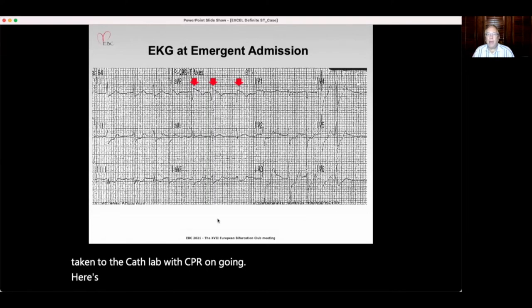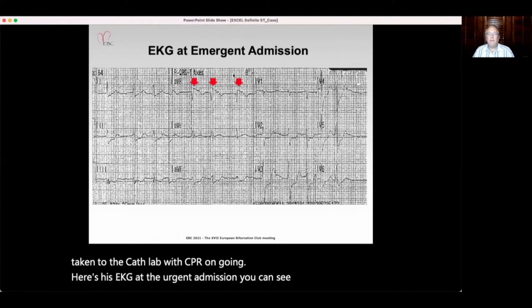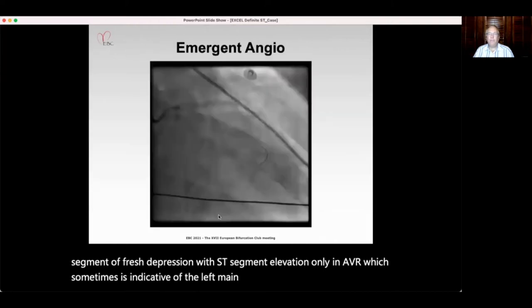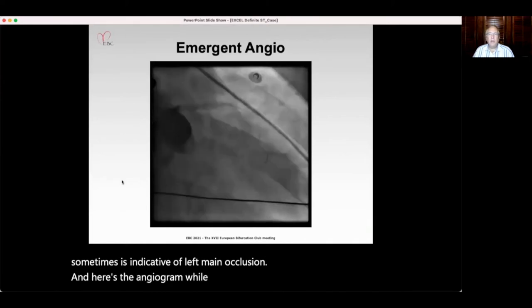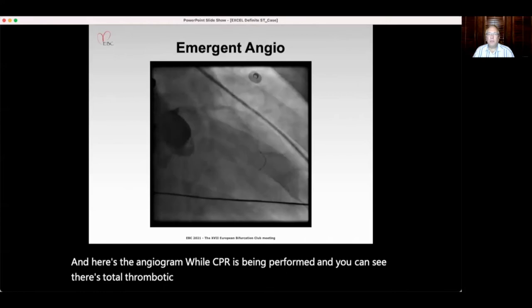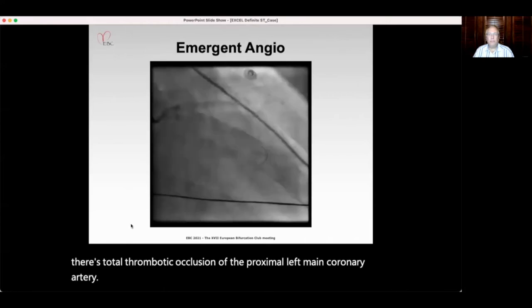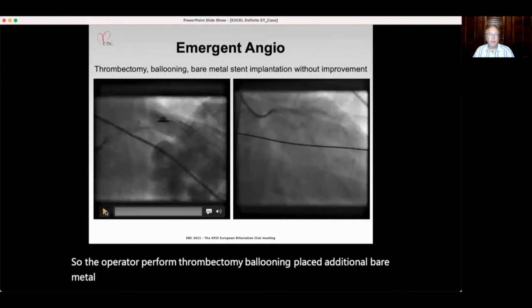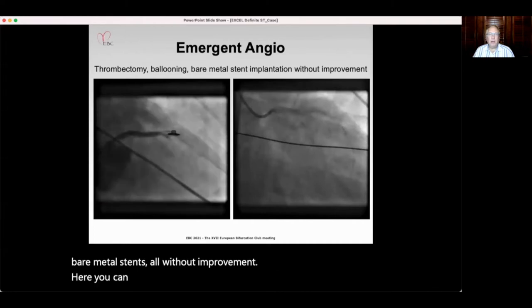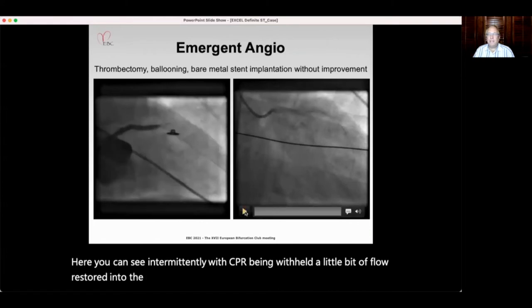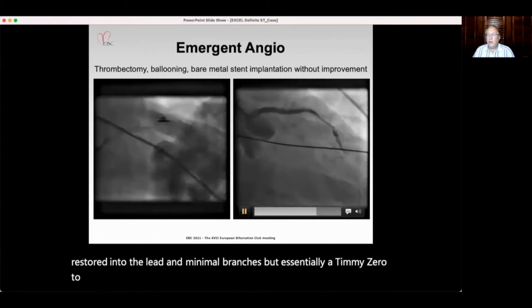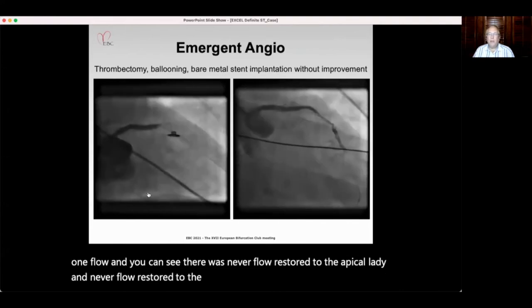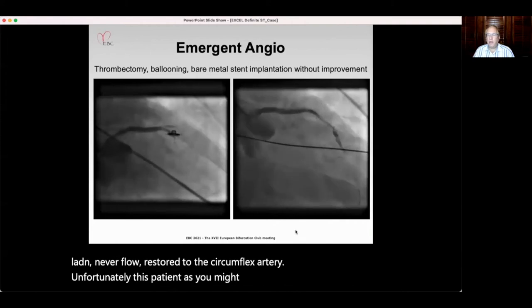His urgent EKG showed marked diffuse ST-segment depression with ST-segment elevation only in AVR, which can be indicative of left main occlusion. The angiogram while CPR was being performed showed total thrombotic occlusion of the proximal left main coronary artery. The operator performed thrombectomy, ballooning, and placed additional bare metal stents — all without improvement. There was intermittently a little flow restored into the LAD and minimal branches, but essentially TIMI zero to one flow. Flow was never restored to the apical LAD or the circumflex artery. Unfortunately, this patient expired in the cardiac catheterization laboratory.